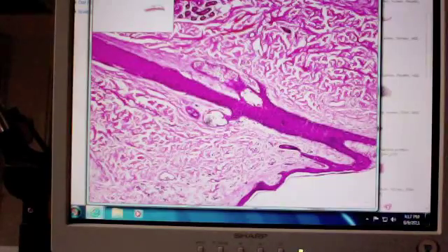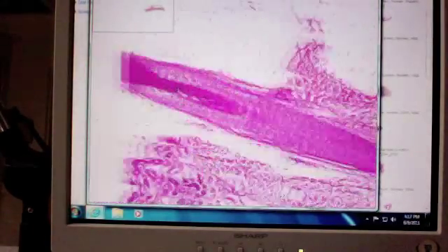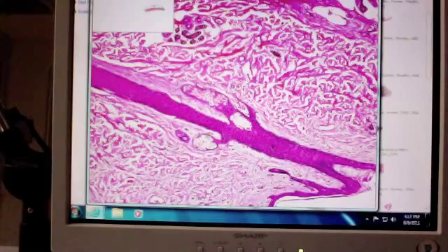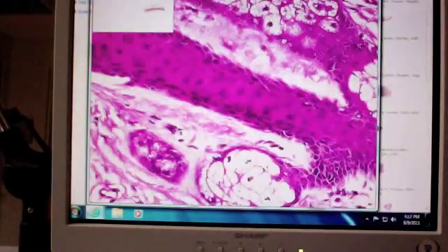And then we go up and we look at this structure, and we can see that it's branched. In this case, although we haven't done skin yet, we're telling you that this is a hair follicle running all the way up to the surface here. And these branched structures belong to what kind of gland?